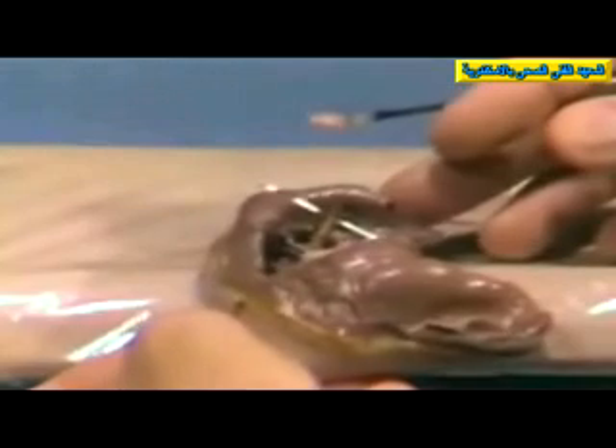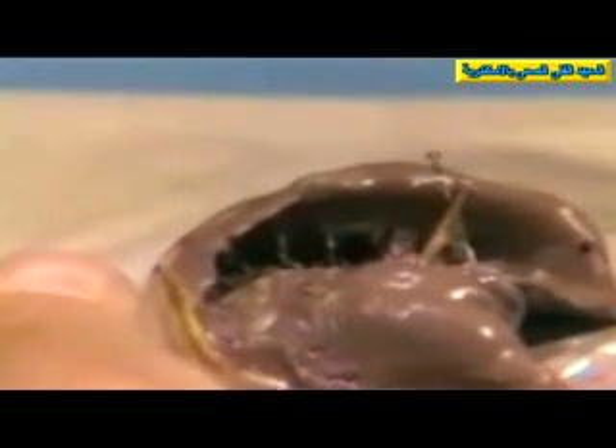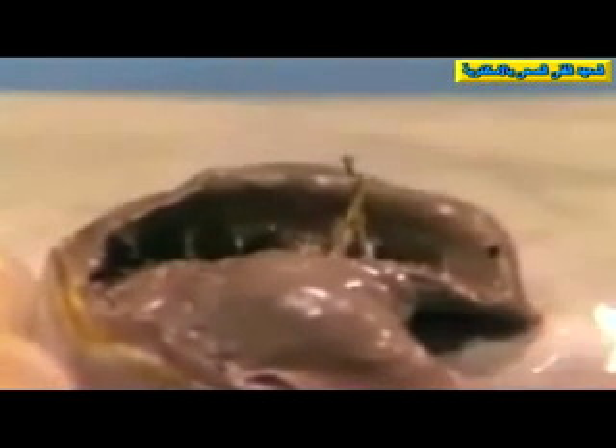It begins to flow over the cervical aspect of that registration and into the occlusal aspect. It's important that that stone be followed very carefully as it flows into the occlusal portion in order to prevent entrapment of air. As soon as that is visible and going across the occlusal portion, additional stone can be added.